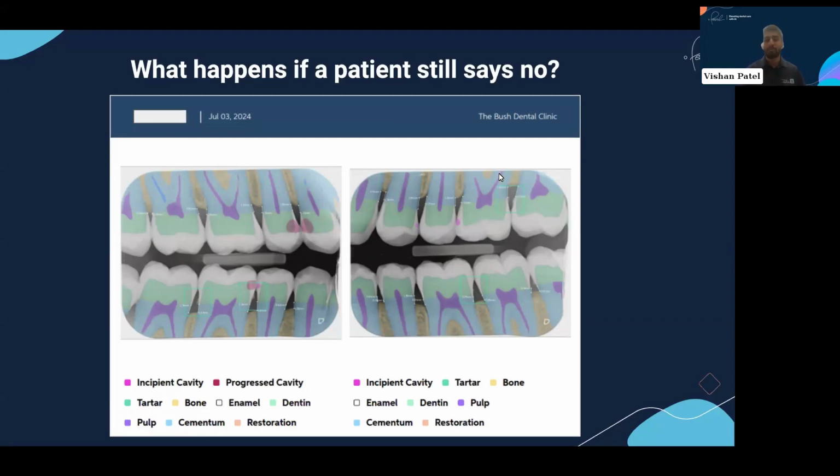This is really important in patients who feel they don't have any symptoms, and they don't believe that they have any decay, or if you can't see a big hole, then there's nothing to do really. So it's really important to give the patient the information so they can see for themselves. And I find this is a lot better than sending just individual x-rays where a patient isn't going to see anything, I feel. So it's a great tool that they've just come out with.